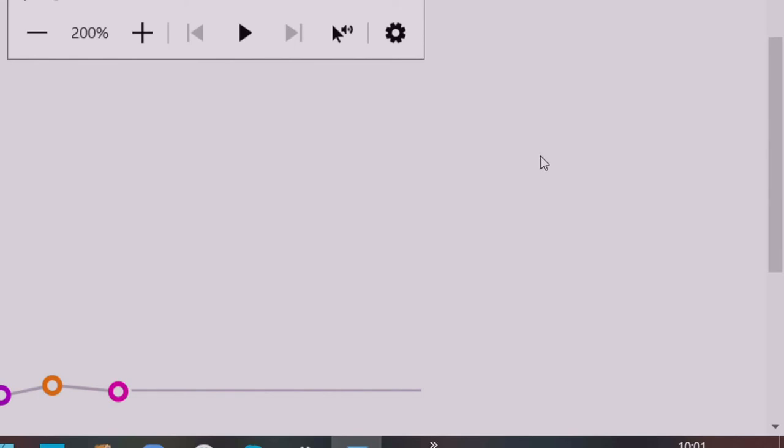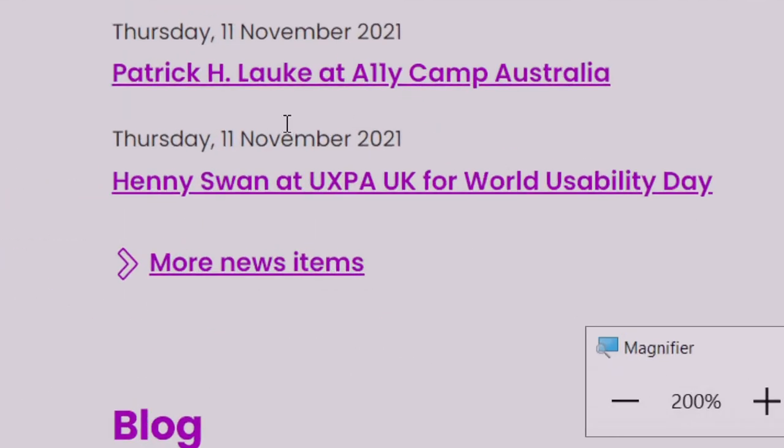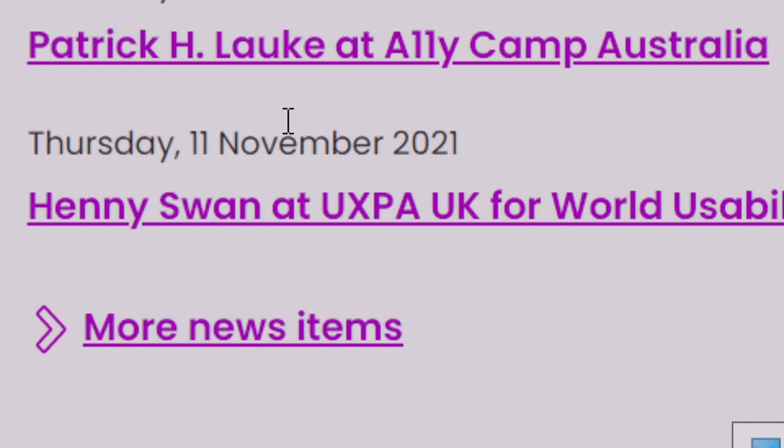When using screen magnification, it can be easy to become disoriented in long web pages or pages with a lot of content or large areas of white space. A common strategy is to zoom out to find your location quickly and then zoom back in again to explore the content in depth.